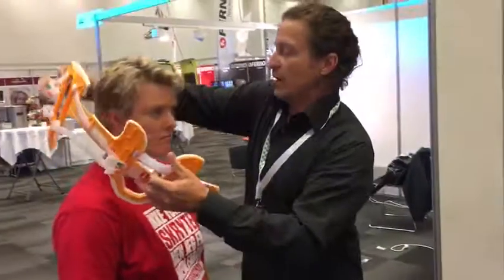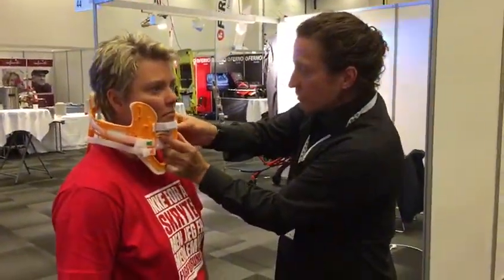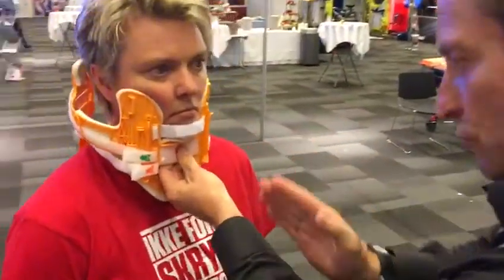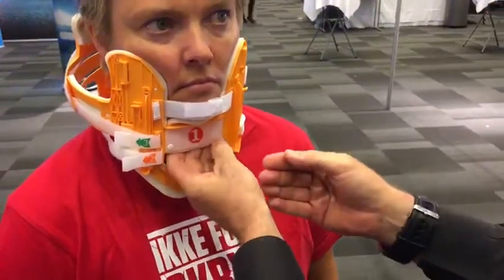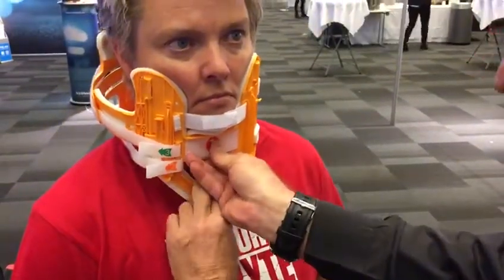We're going to secure the patient. Notice how we control the patient without manipulating — one hand controls the head, the other hand makes adjustments. It's better to make adjustments on the patient because it's more precise.